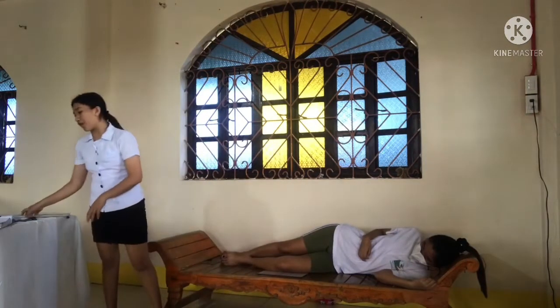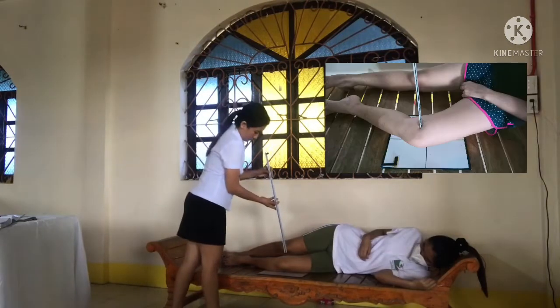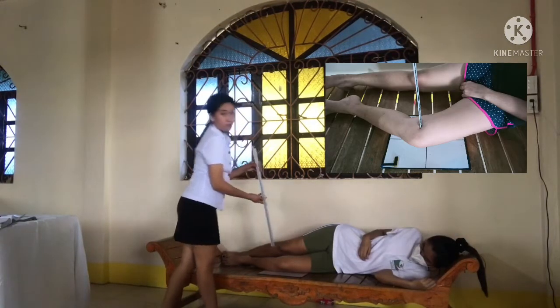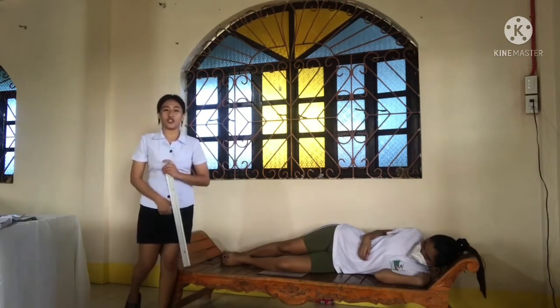So the central ray for this projection must be directed to the knee joint 1 inch distal to the medial epicondyle at an angle of 5 to 7 degrees cephalad. So this shows a lateral image of the distal end of the femur, patella, knee joint, proximal ends of the tibia and fibula, and adjacent soft tissue.